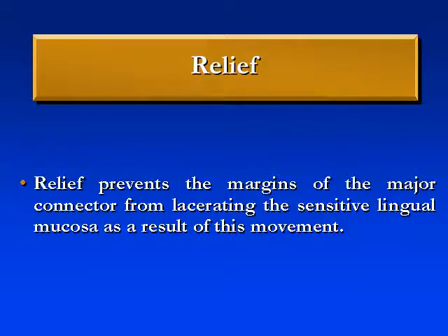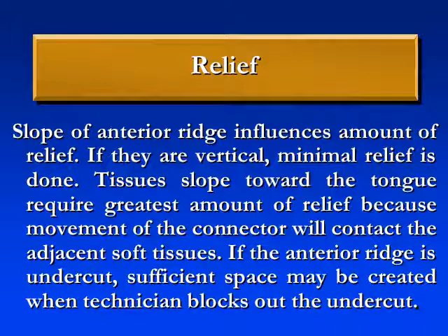Relief prevents the margins of the major connector from lacerating or destroying the sensitive lingual mucosa as a result of this functional movement. Now, why do we use relief and what are the stages of using relief? The slope of the anterior ridge influences the amount of the relief.